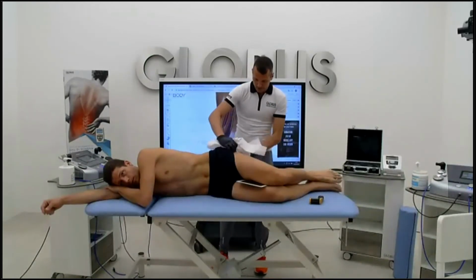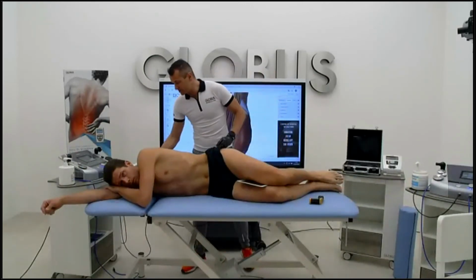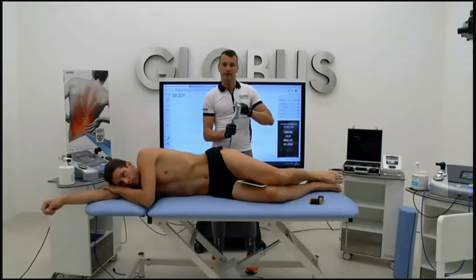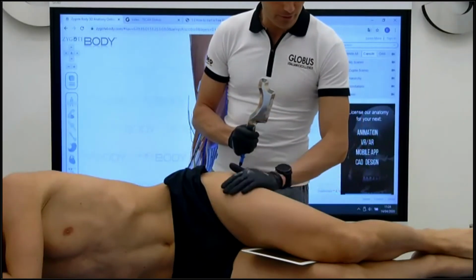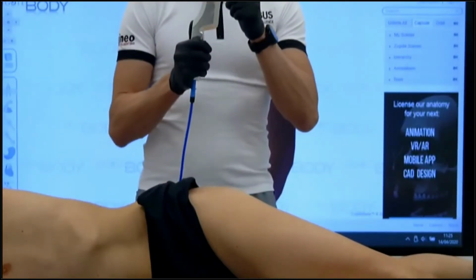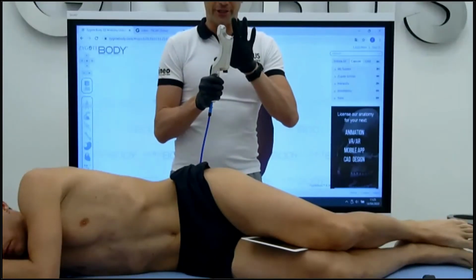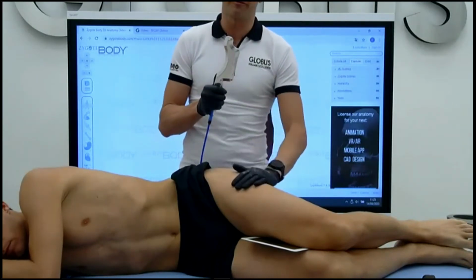Okay. So we are speaking about using the curved edge. Maybe here you can have a look better. This is the perfect way to treat, because what's the difference between the linear edge and the curved edge? Here, the pressure will be homogeneous for a rounded surface.